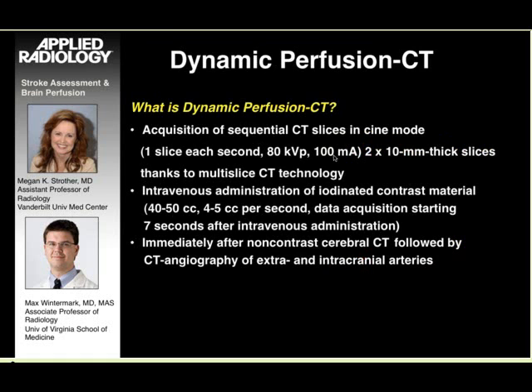The other large group of perfusion CT techniques is called dynamic perfusion CT, and in that particular setting, things are different. You are basically going to use your CT scanner as a monitor while you inject a relatively short bolus of contrast, typically 40, 50 cc's, and you are going to leave your CT scanner gantry in exactly the same location, and you are going to monitor over time with successive slices at the same location how the iodinated contrast is washing into the brain and then washing out of the brain.